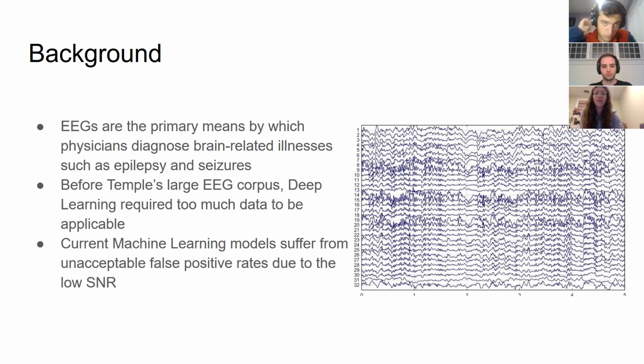There are a few models on the market, but all of those models suffer from having too high of a false positive rate. And so therefore, no doctor will ever use them.